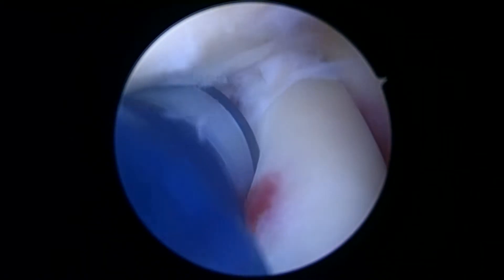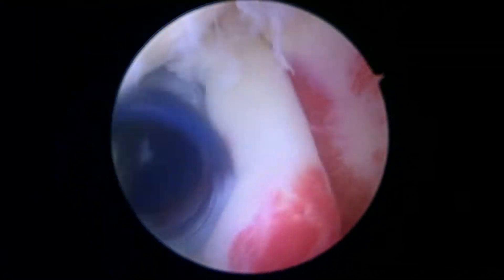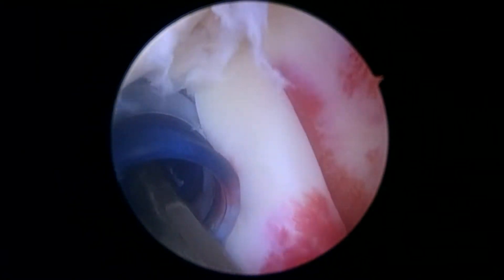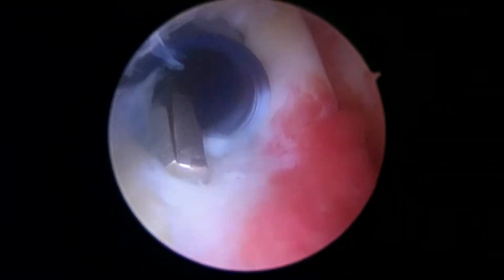Here's the biceps tendon as it exits the shoulder. And here we can see a type 2 SLAP lesion. We can see the biceps anchor is torn right here. We can also see some additional labral tearing, but for sure the biceps anchor is torn, and this is what your symptoms are suggesting. We can see some redness here, some inflammation.